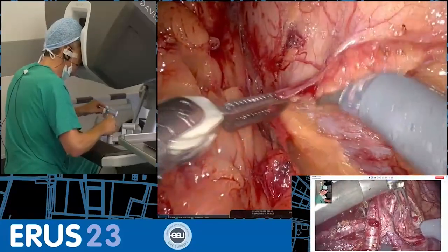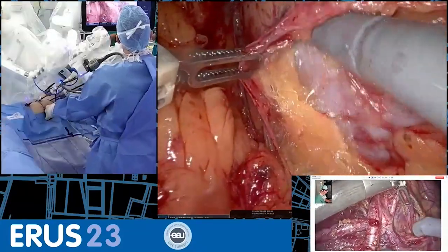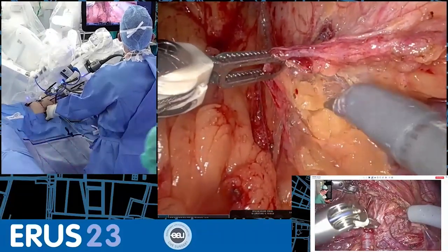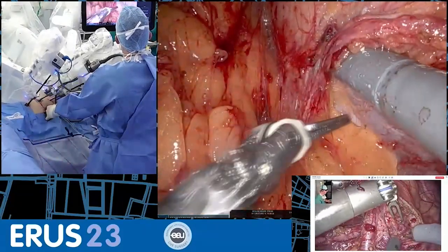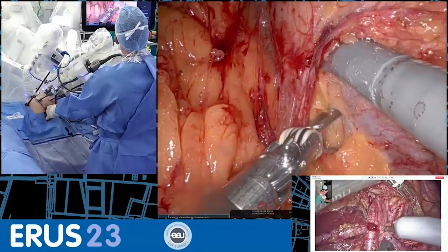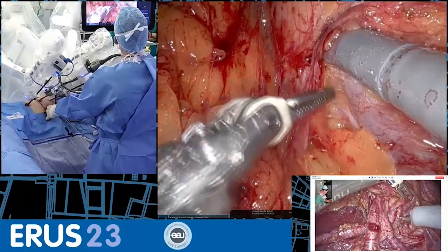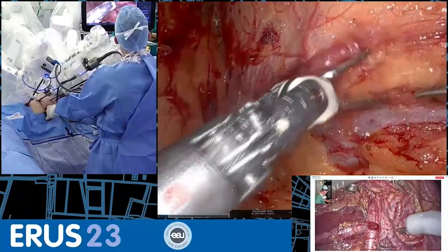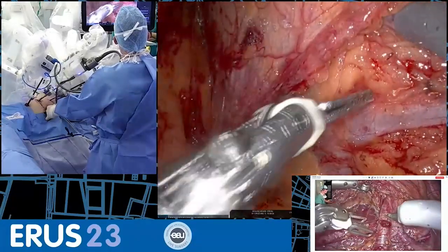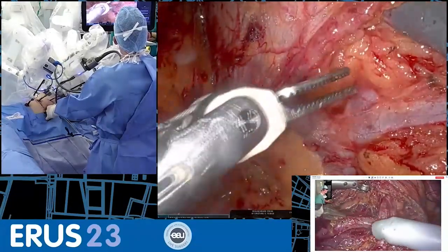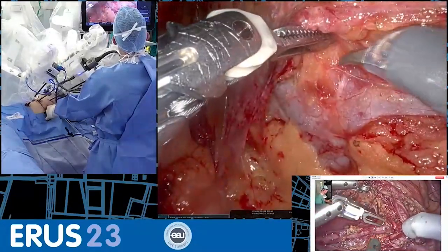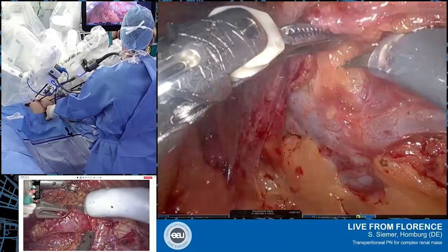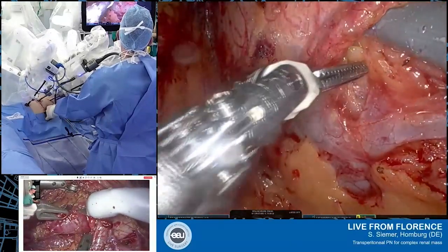You can see the vein here already, and this is the supra-adrenal vein. On the left side, you also normally have the lumbar vein — be aware of that. This is sometimes a little bit tricky.